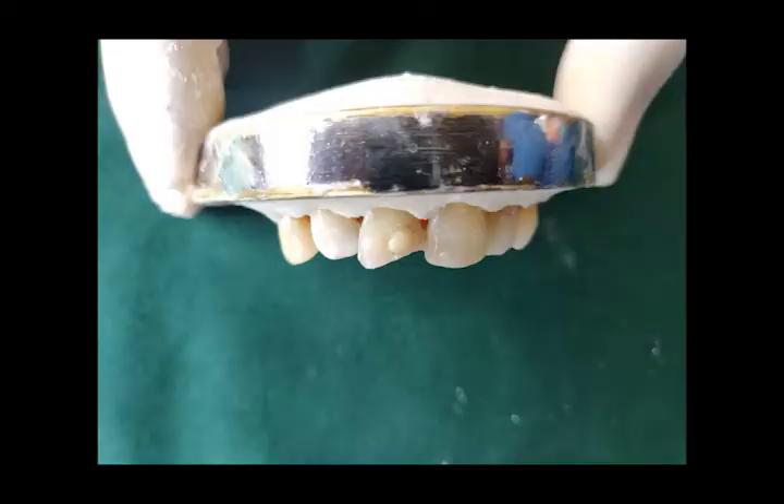Following which, shade selection is done by button technique. A3 is the shade selected in this case. The point to be noted is that in this case we have used a single shade; however, in the majority of cases, 2-3 shades need to be mixed in order to obtain a desirable match.